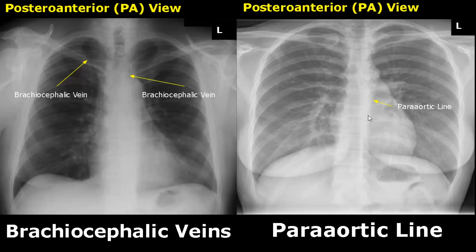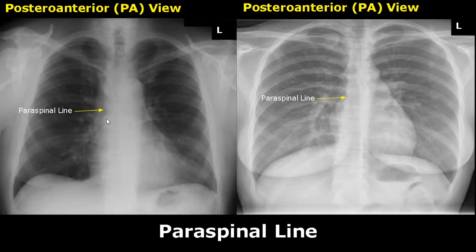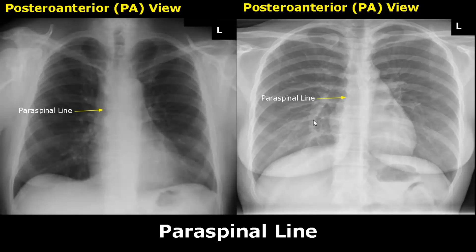The paraaortic line is formed by the wall of the thoracic aorta and the descending aorta. The paraspinal line is seen on the right side of the patient, and we can see this border of the thoracic spine.